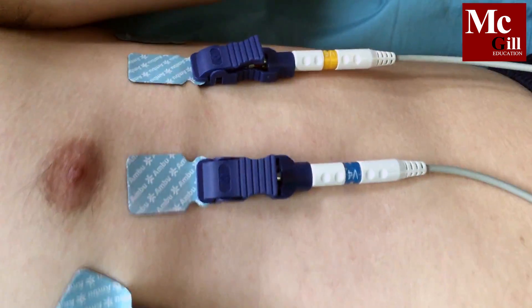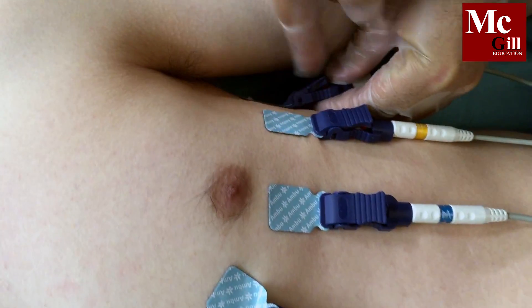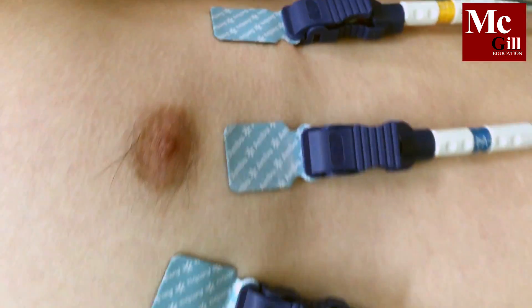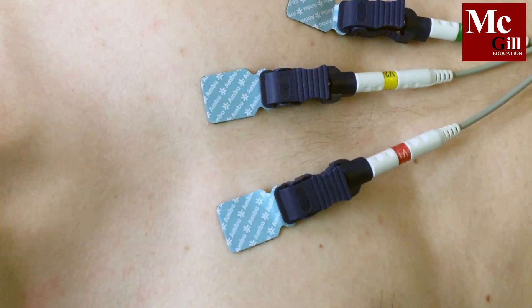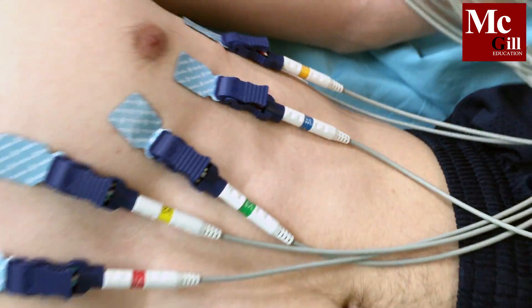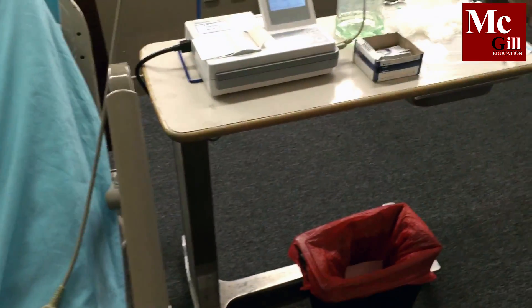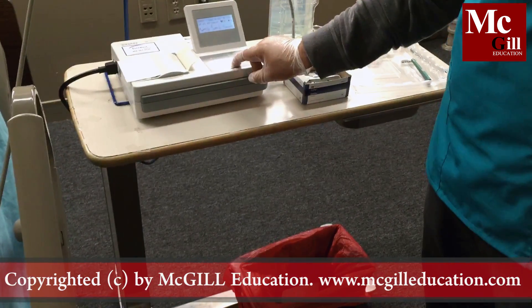Ask the patient to lie still and breathe comfortably. Now you can select print or save. Different EKG machines use different formatting. This EKG machine uses a USB to save the data, which can also be entered into an electronic health record system.